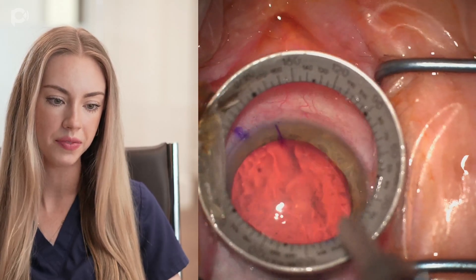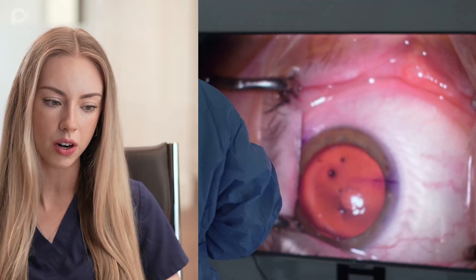This is able to speed up Dr. Jack and Dr. Parker when they are doing cataract surgery, because now they can just sit down and know exactly where the lens needs to go. Previously, this part of the surgery was done with a leveling instrument, which is not as accurate. This app has really helped us improve our accuracy in putting the toric lens exactly where it needs to go. Toric lenses have to be placed at a very specific spot to correct for astigmatism — if they're off even the littlest bit, the resulting vision is just not going to be as good. So this speeds up the doctor considerably before he even gets in the room. That is how we mark the eye for our toric cataract surgeries. Thank you so much for watching.